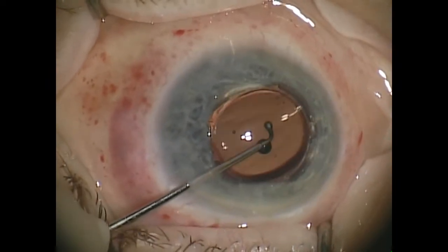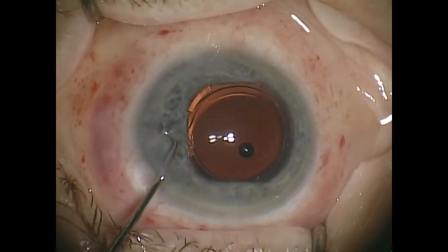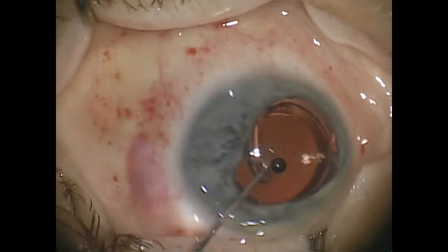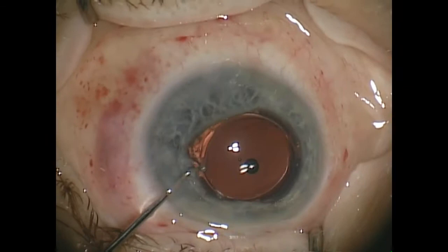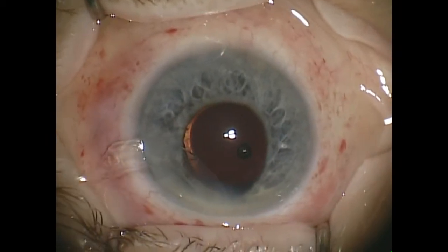And this shows you the lens is situated — it easily fits into that range. We're going to catch one of the distal portions of the fenestration and the iris dilator is removed very easily.